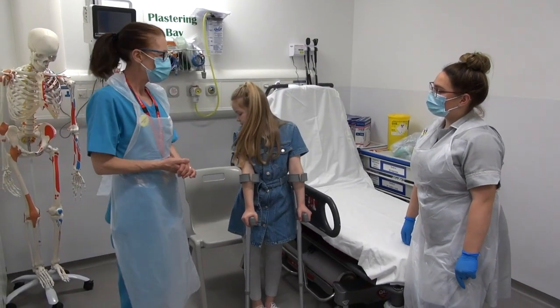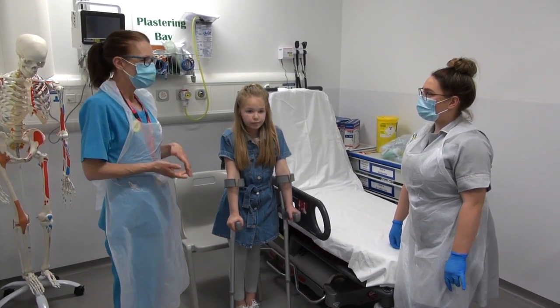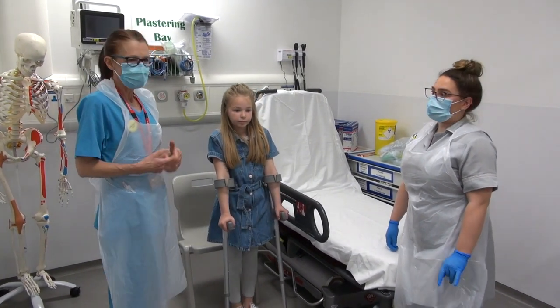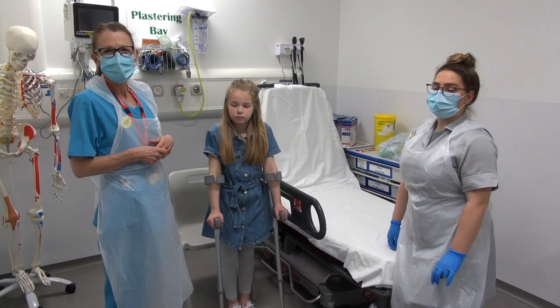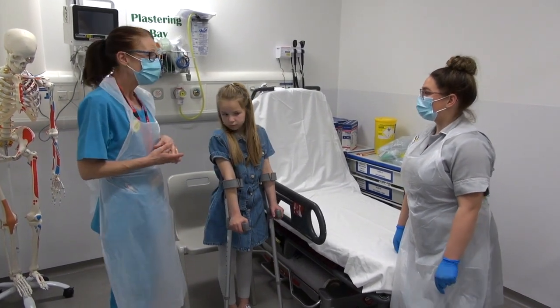Lucy's going to teach Ellie to sit and stand using the crutches. It's important you advise your patients to use the appropriate chair — something that is not too low, like a sofa where they have to push themselves out from a very low position. Something a little bit firmer, preferably with arms as well, is really useful. Lucy's going to demonstrate that.